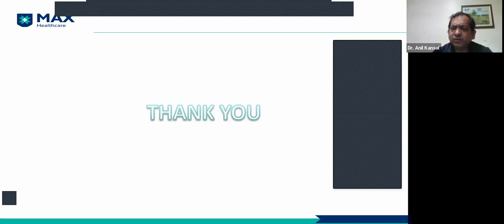Another is that we might have to change the settings of the patient, so the patient needs to visit our country frequently. Some new devices are available where we can change the settings on mobiles from here. But the major problem is the change of the battery: if chargeable, it lasts around 15 years, or if non-chargeable we have to change the battery after maybe 6-7 years. That's it.